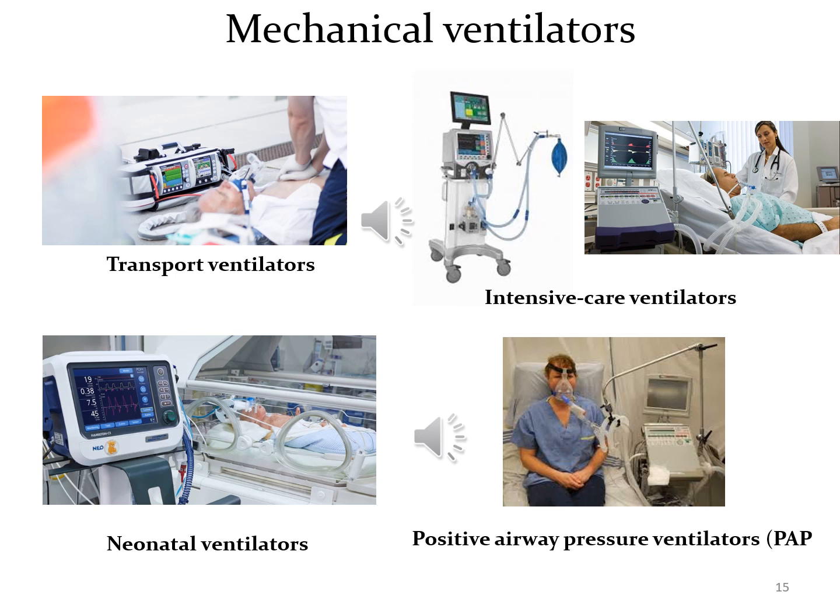Neonatal ventilators. These are a specialized subset of ICU ventilators that are designed to deliver the smaller, more precise volumes and pressures required to ventilate these patients. Positive airway pressure ventilator. These ventilators are specifically designed for non-invasive ventilation. This includes ventilators for use at home for treatment of chronic conditions such as sleep apnea.